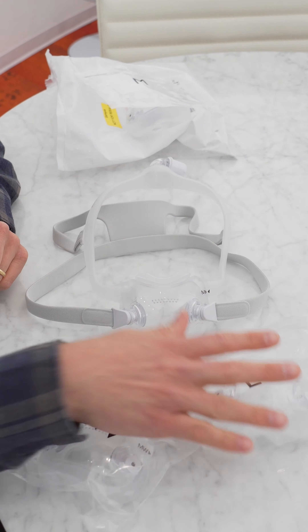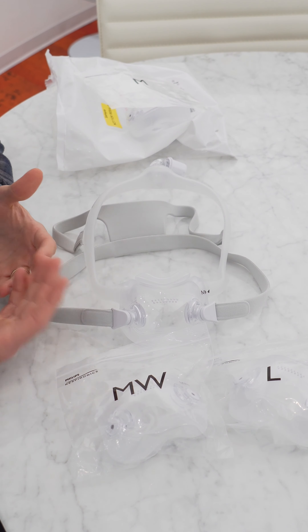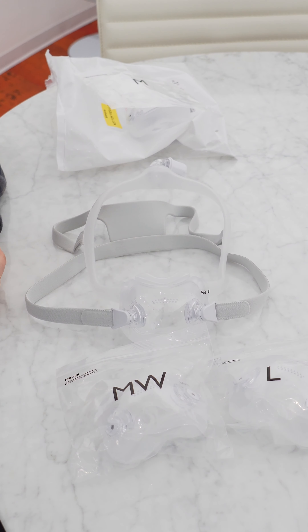You can switch out for any size you need. What we really like about this mask is it comes with all of these sizes included, so you don't need to worry about measuring yourself before you order it. You can just order it and then figure out which one works best for you as you're getting started.